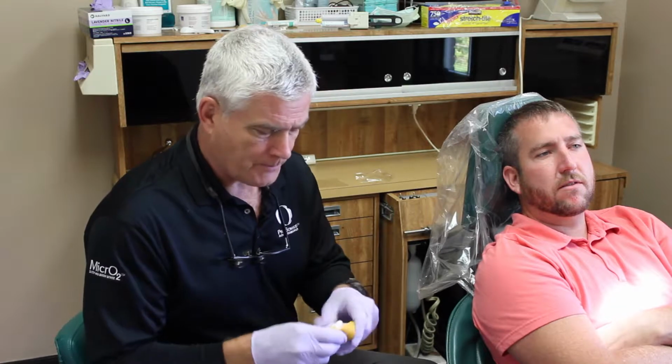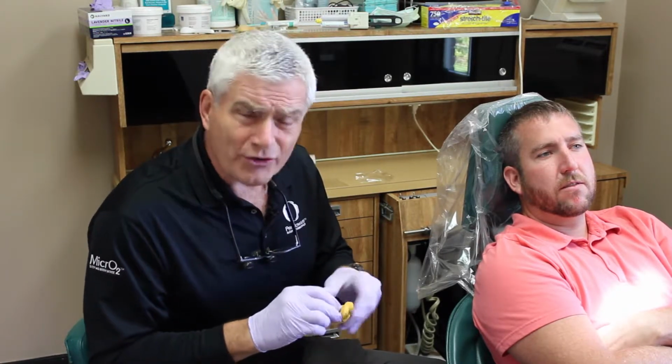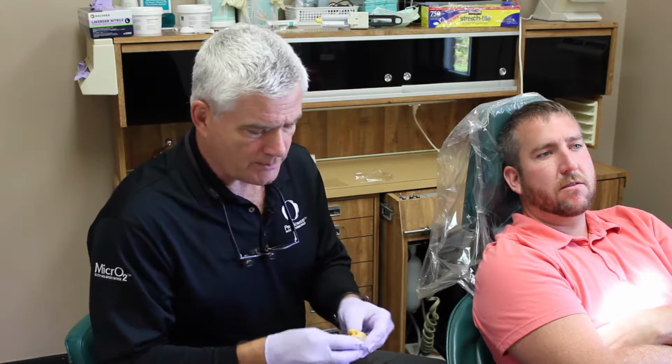Hi. Today what we're going to be doing, and of course I'd normally be doing this with a mask on, but I want to make sure you can hear me loud and clear, is we're mixing up some impression material, and I'm going to demonstrate for you a really predictable impression taking technique for full arch activities. Especially if you're going to make a sleep device for one of your patients, you're going to need an exquisite, great detailed full arch impression. This technique comes from the orthodontic world, and it will do a great job of giving you an impression that you can count on predictably every single time. Exquisite detail. The only caveat is it uses a lot of material because it's full arch, and it takes just a little bit more time.